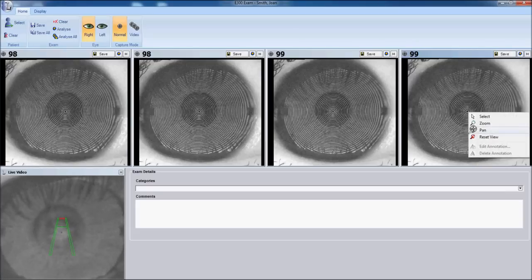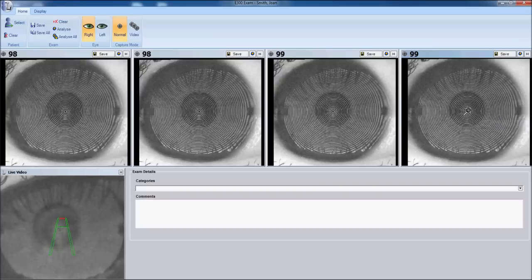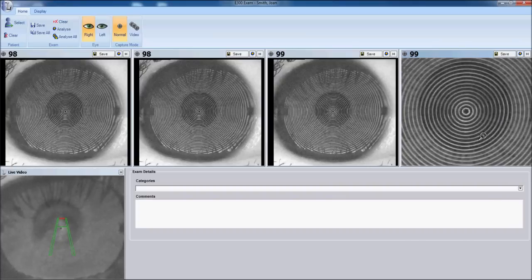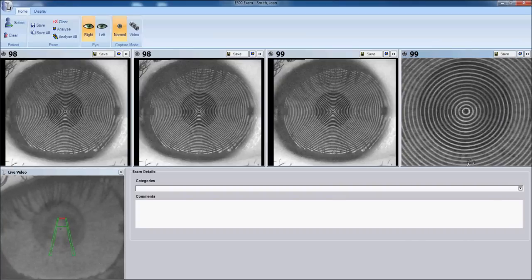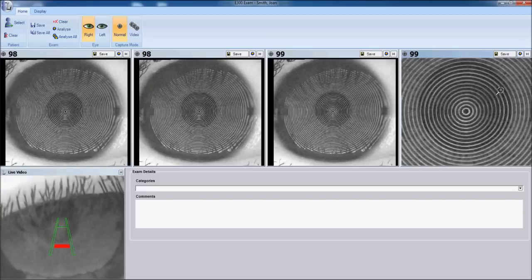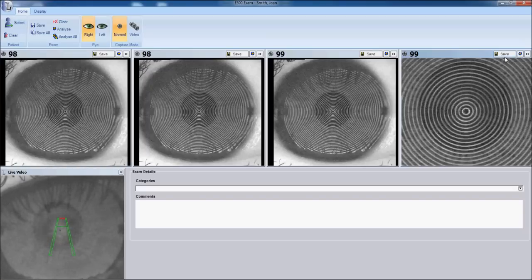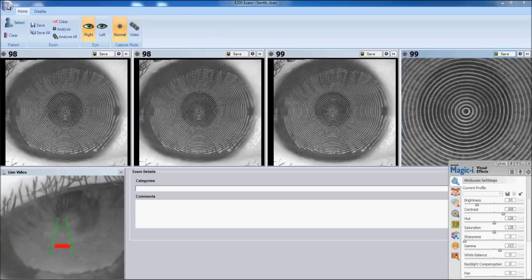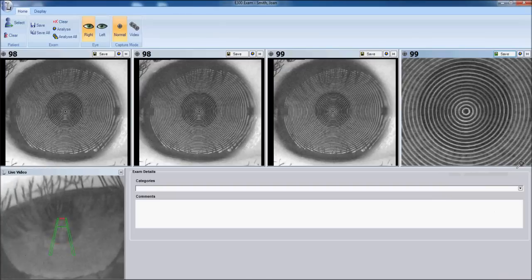Our right most image looks like we have a large percentage of corneal coverage. We can right click. Select the zoom tool. Zoom in on the central 10 to 15 rings. They all reflect parallel and even. This would be an excellent capture. So we will click save to save that into the patient file.